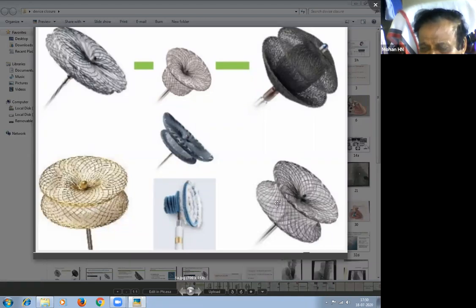millimeter. So for more than 12 mm, the waist length will be 8 millimeter, and the discs will be 8 millimeter extra. So a 12 millimeter VSD means 12 plus 8, a 20 millimeter LV disc. The RV disc will again be 20 millimeter. Waist length will be 8 millimeter. So this is the muscular VSD device.